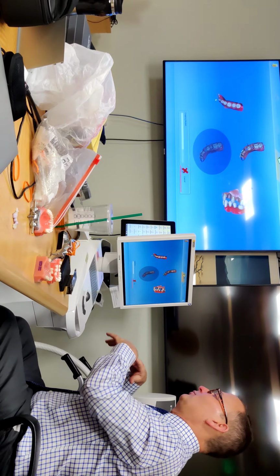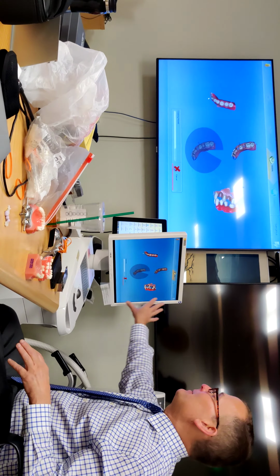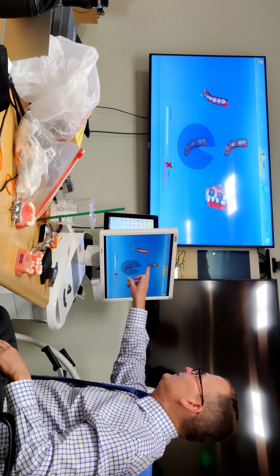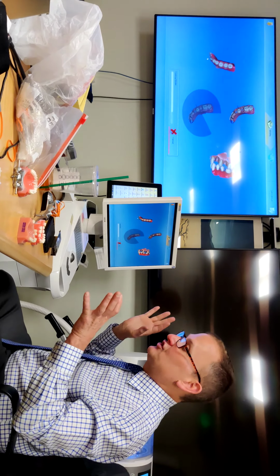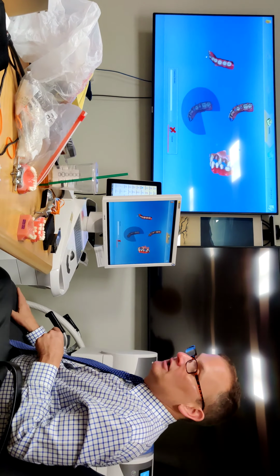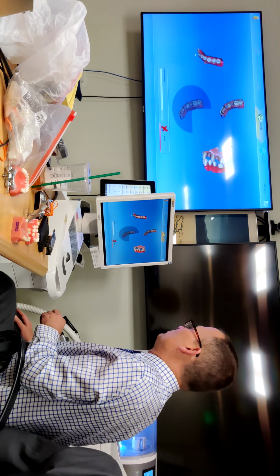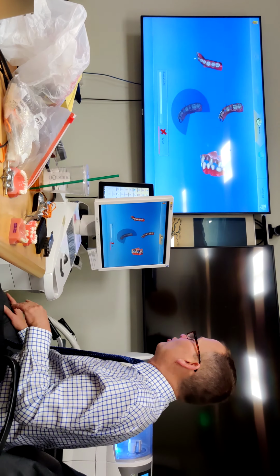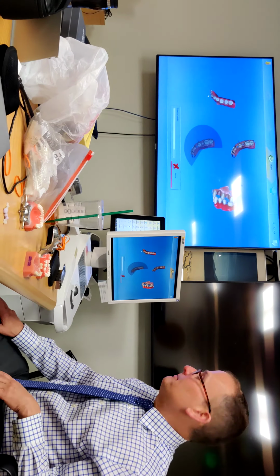This one, it takes a little bit longer, but it's great because you used to not be able to see anything, and they've added this so you can see it counting down. Because people would get anxious, like, is it crashing? What's happening? Is it working? So it tells you, yes, it's working. Just calm. Okay, this would be a great time to go to the restroom or look up something on the patient's chart. Take the scan body out of the patient's mouth.